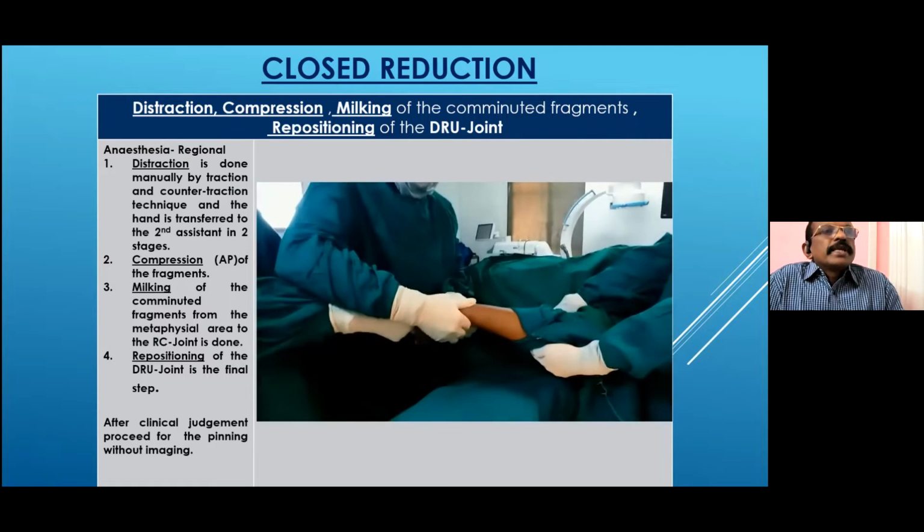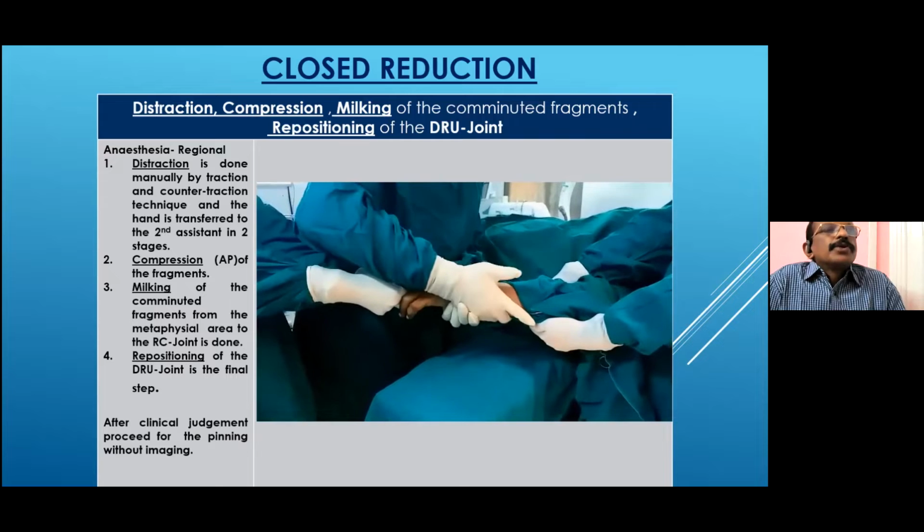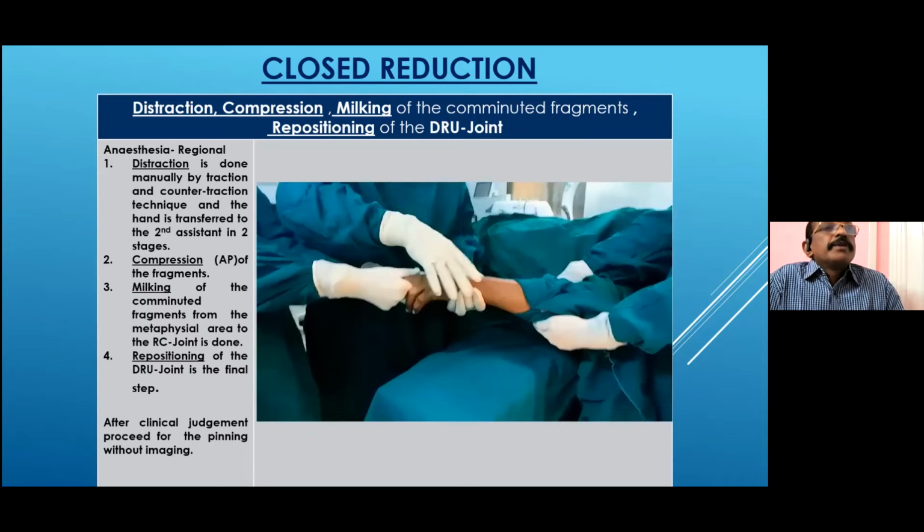In the ligamentotaxis position, this milking is the main technique, so that all the fracture fragments can be positioned into their original condition. And after clinical judgment, we proceed for the pinning without imaging, because we cannot lose any time; if the surgeon's or the assistant's hand becomes fatigued, then all the reduction will be lost. So without checking the imaging, we will directly go for pinning.